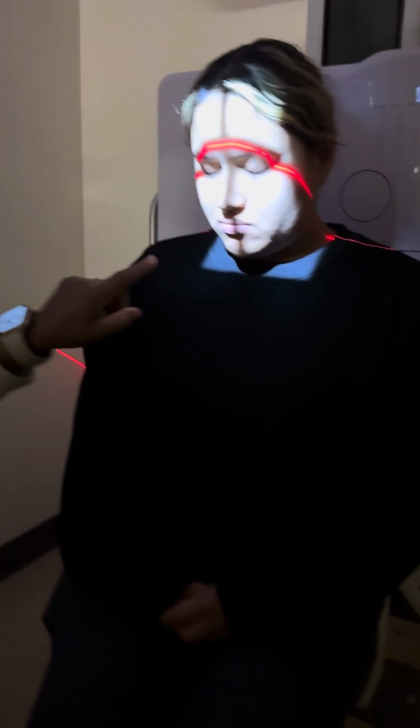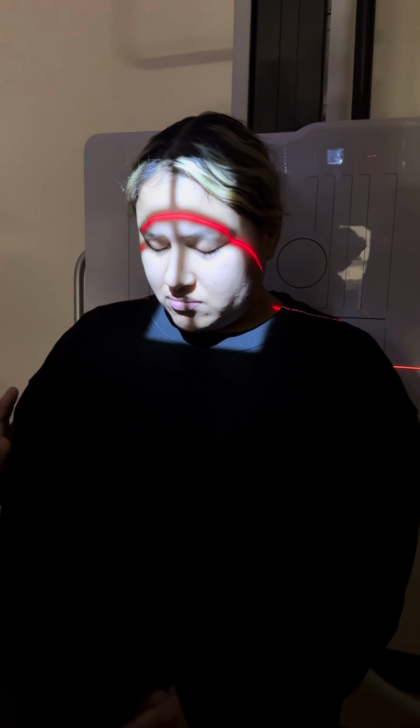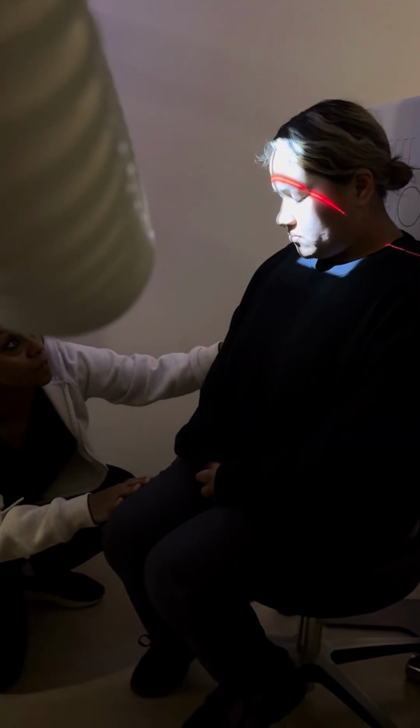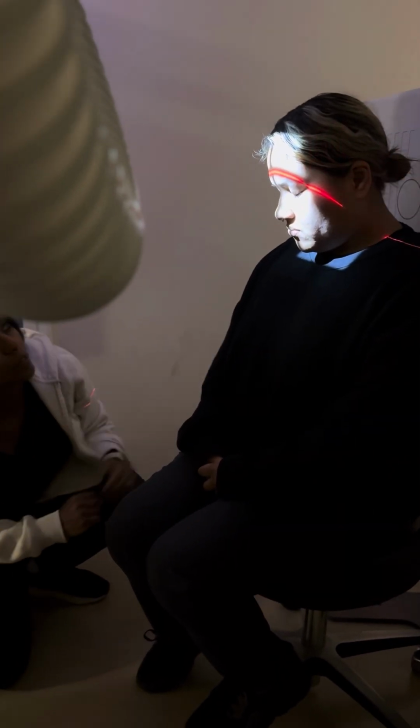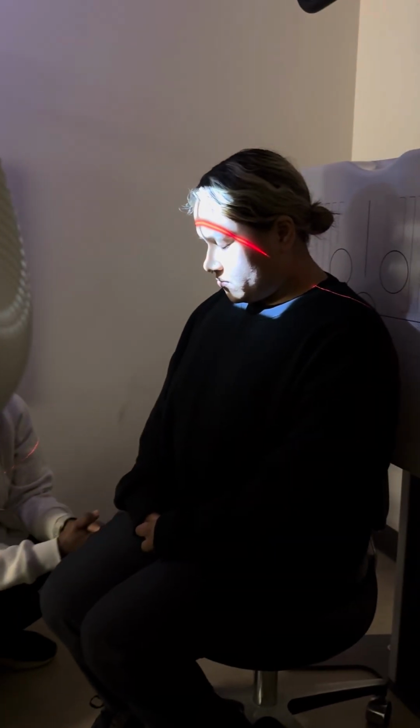Should I drop it? She needs to make sure she's mid-sagittally set up. Go ahead for me. All you need to do is make sure that she stays in a tucked position. She ends up having to create a real tucking or flexion in terms of creating an OML line. Others not as much, but for her, she definitely has to. And you're still going with the OML line? Correct. It's always the OML. It'll never change in terms of all projections.